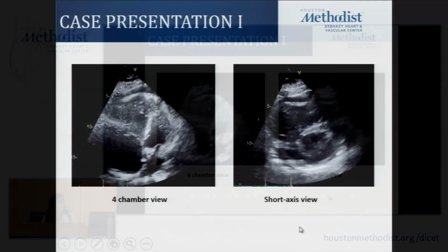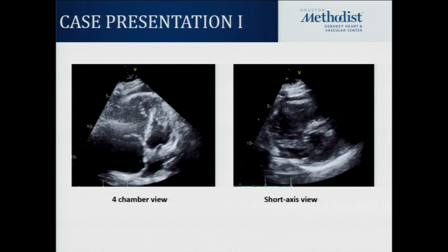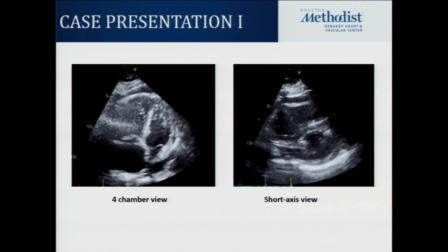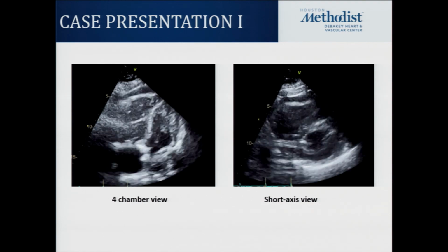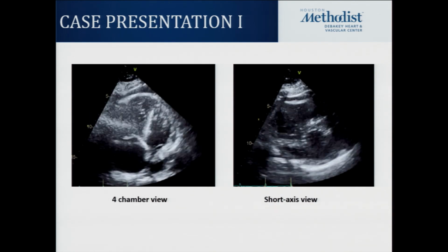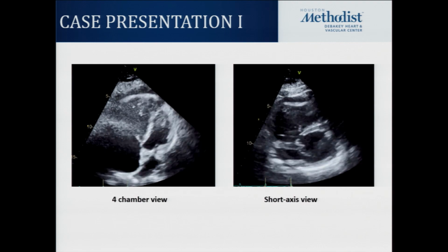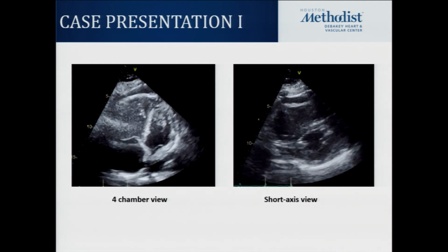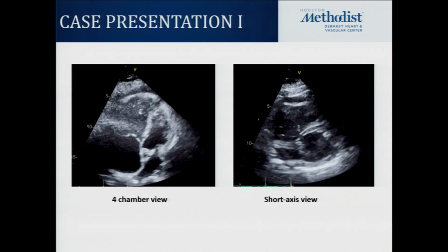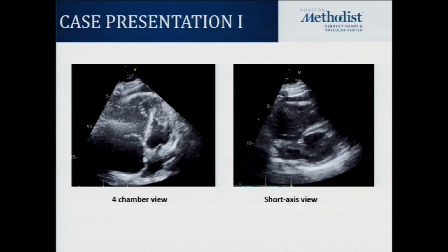So what we see here is this. There is a squished structure, and there's a structure that's huge. There is an underfilled small left ventricle with an underfilled small left atrium, but the right atrium and the right ventricle are huge, and the septum is completely deviated towards the left. Now, the second image is the short axis view, where we cut the heart in a short axis kind of way. The smaller circular structure is the left ventricle, the bigger structure is the right ventricle, and the right ventricle again is huge and pushing over or squishing the left ventricle. That's my simplistic way of explaining this.